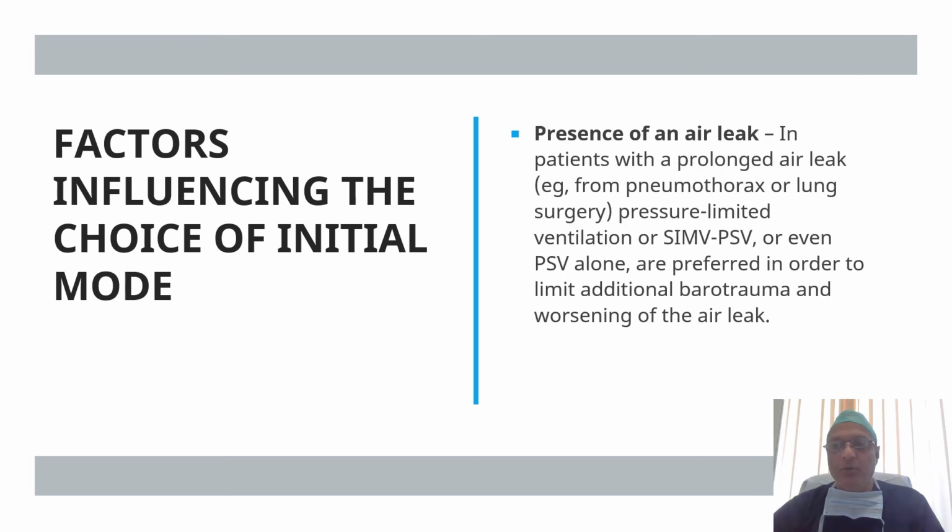While in the presence of an air leak, like in patients with pneumothorax or lung surgery, pressure limited ventilation or SIMV with pressure support or even pressure support alone are preferred in order to limit additional barotrauma and worsening of the air leak.